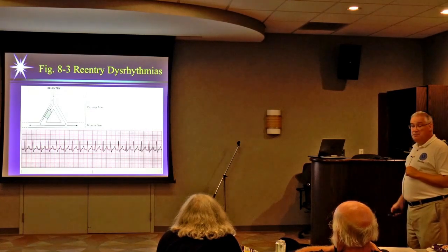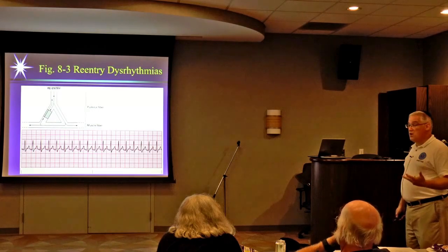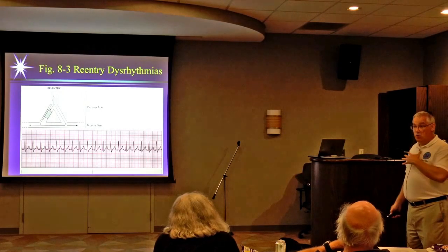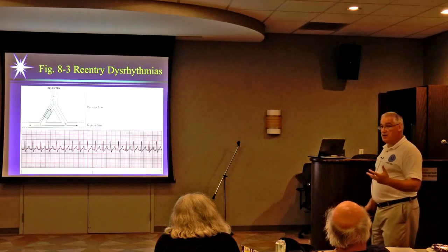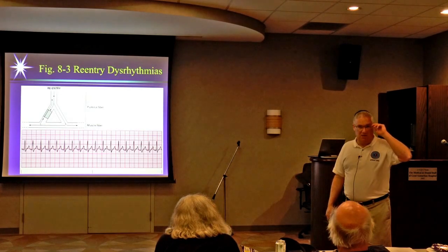Now, you can get some people that go into these rhythms, and they could actually break it themselves. How do they break it themselves? They bear down, they do these different procedures, okay, but sometimes it doesn't work, and sometimes we have to come and treat them. Eventually, if this happens enough times, they're going to get a Holter monitor put on them, okay? They're going to see it on the Holter monitor, right? A Holter monitor is just an EKG they wear around that they could download, 3 days, 5 days worth of EKGs. They're going to see it happen, okay?